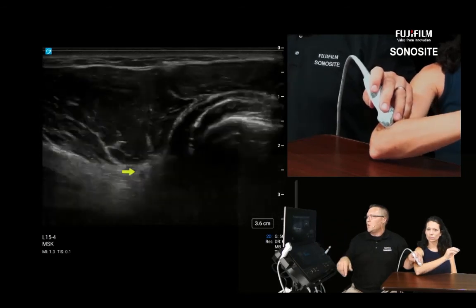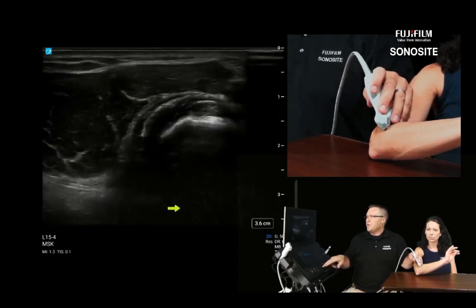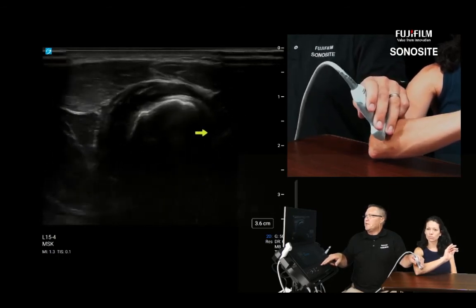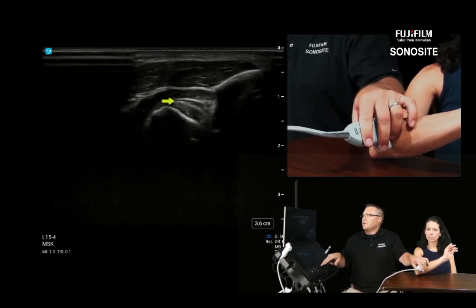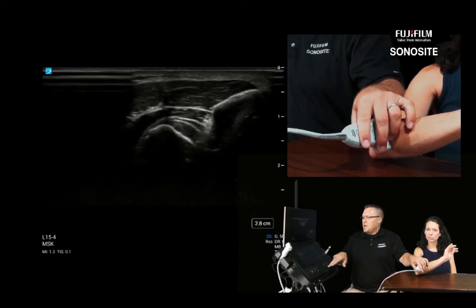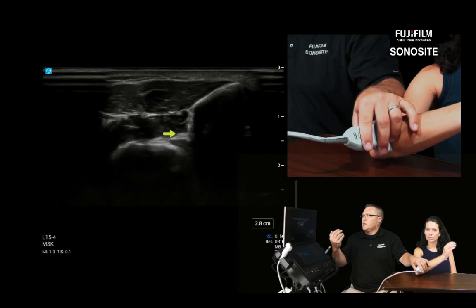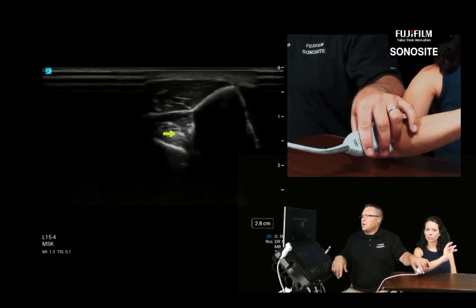So I'm going to have her pronate. And while she's in pronation, I'm going to segue to the posterior window. So when she's in pronation, the radial tuberosity has now moved itself posteriorly and squeezing up between the ulna and the radius. So here I'm going more posterior, posterior, posterior, and you'll see another little bird's beak has wrapped itself around. Bring our depth up for perspective, and now we have the ulna and the radial tuberosity here. So I'm going to have Jamie supinate and pronate again, and then bringing it forward very nicely there.